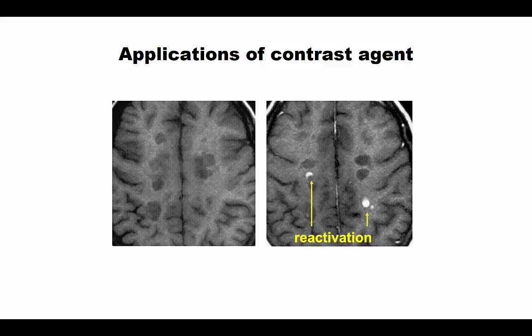If it is a T2, the image with the contrast agent would be darker, you remember? So this should be a T1 contrast agent. The popular T1 contrast agents are either manganese or gadolinium.